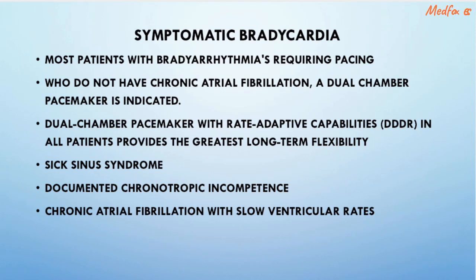Rate responsiveness in a patient with chronic atrial fibrillation depends on autonomic regulation of the AV node, which is generally poorly regulated in these patients, necessarily requiring sensor driven pacing.